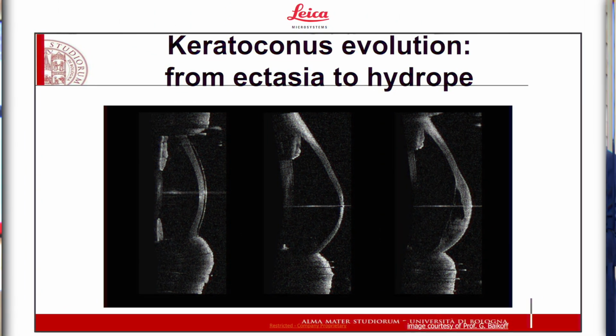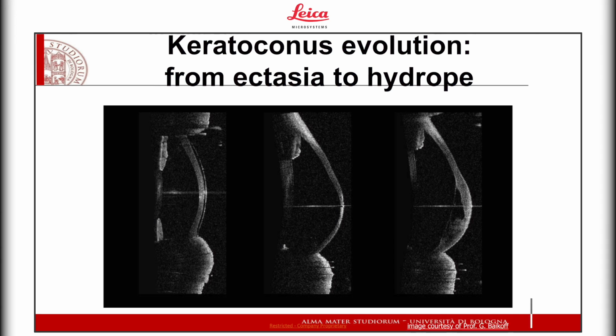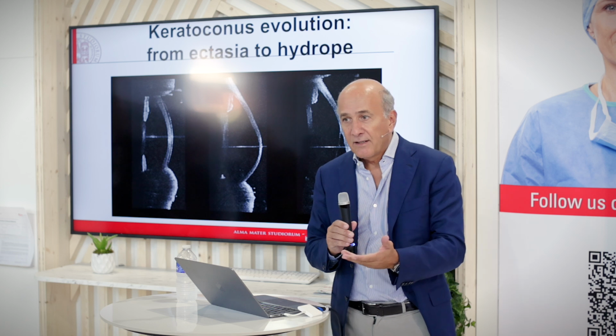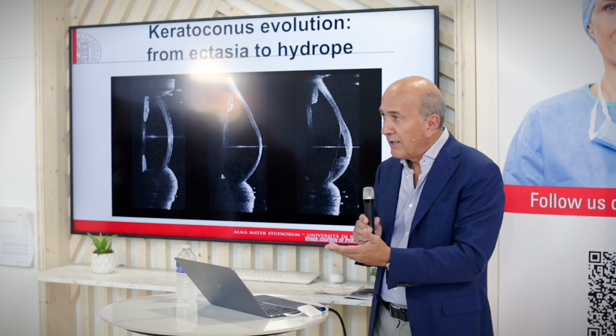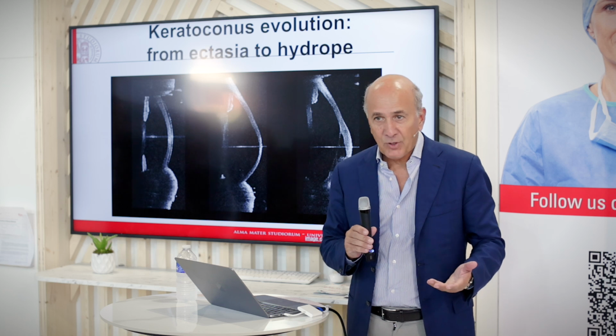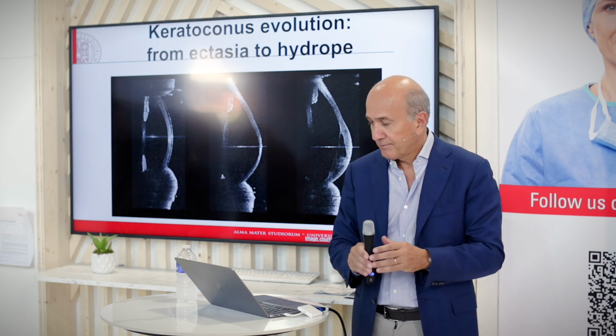So you may or may not believe that an integrated OCT could actually be a benefit for your surgery. So I may assume that you are the major skeptics in the world, thinking that an OCT is a waste of time and a waste of money. Let's assume this.